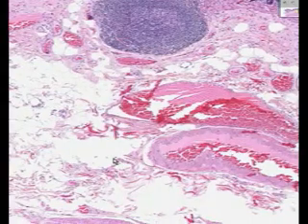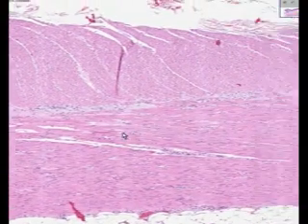Notice, once again, you have another quite abrupt transition, and you can now see the beginning of your smooth muscle layers, circular on the inside, longitudinal on the outside. It is between the circular and longitudinal layer that you're very, very likely to find little ganglion cells, like here and here and here.